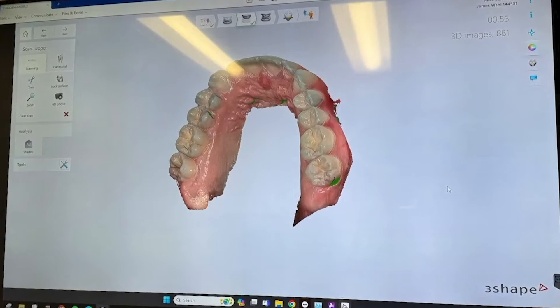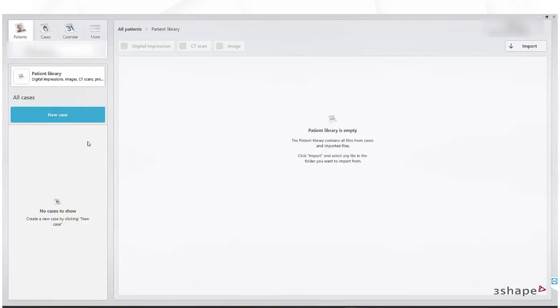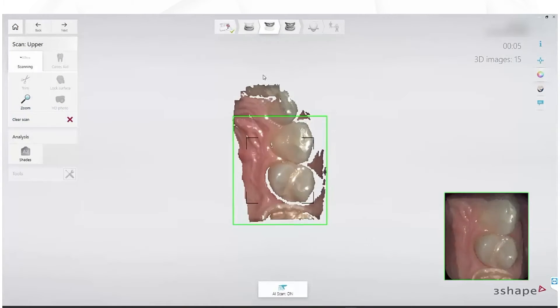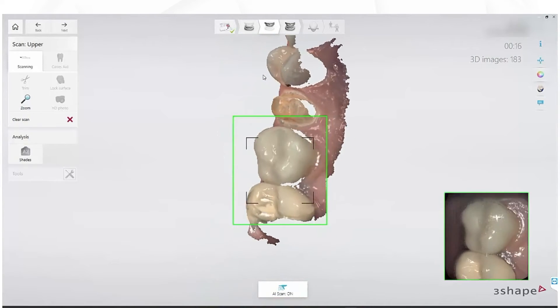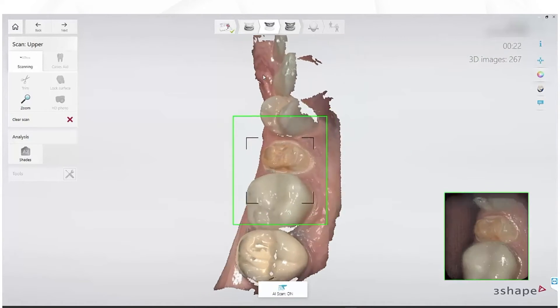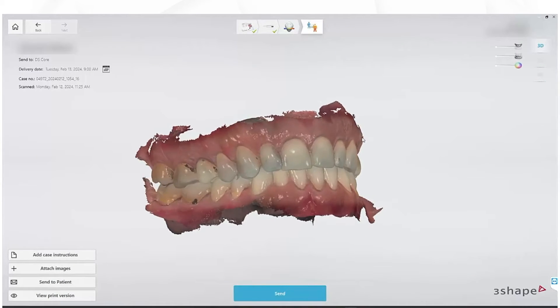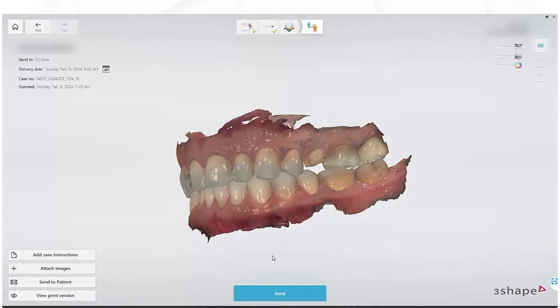It has really been a wonderful addition to our office. Here's how it works. First, from the 3Shape Unite software, you simply select DSCore when starting a new scan. Next, you scan for whatever application you're doing — in this case, it's for a single unit crown on a bicuspid. Once the scan is complete, you send the case off, and that's it — it's wirelessly off to DSCore.